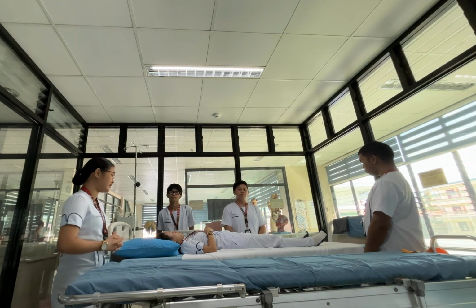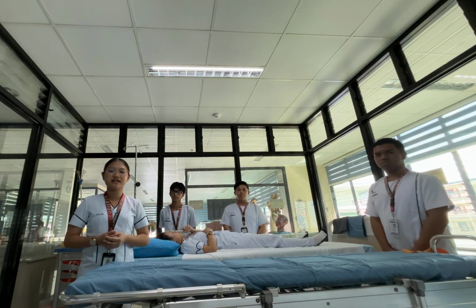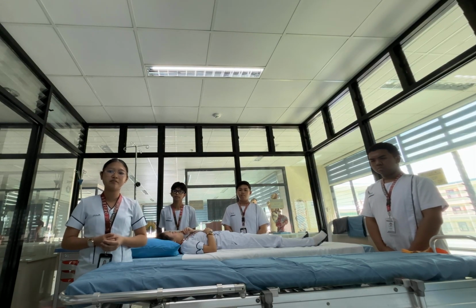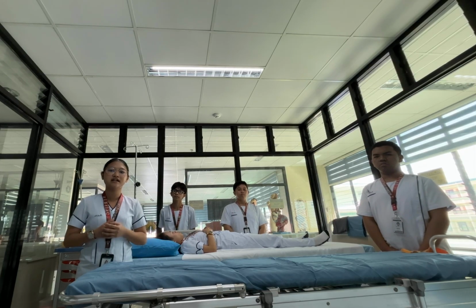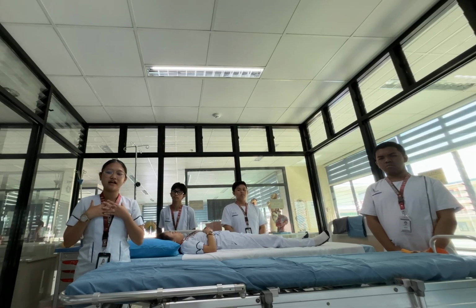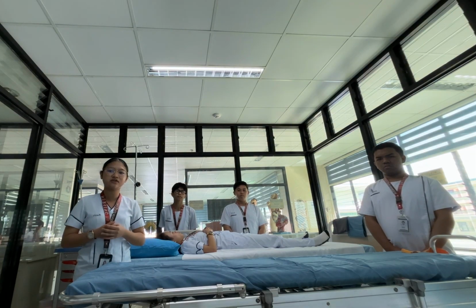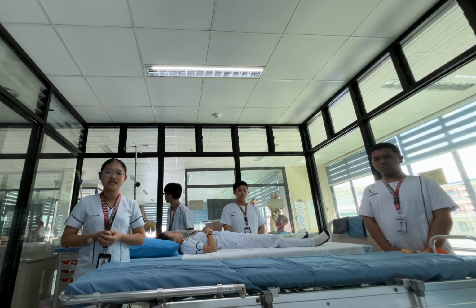For the procedure, first check the patient's chart for a physician's order to transfer the client from bed to a stretcher, and check for restrictions that may influence the client's ability to move or be positioned. Assuming we have already checked the physician's order and there are no restrictions for the patient, let us proceed to the next step.